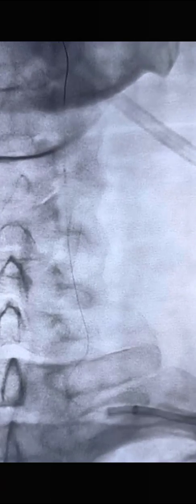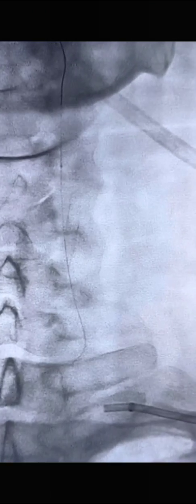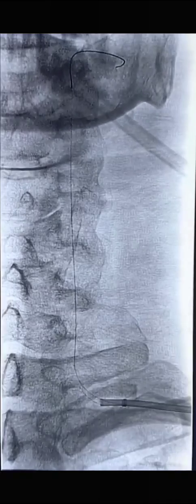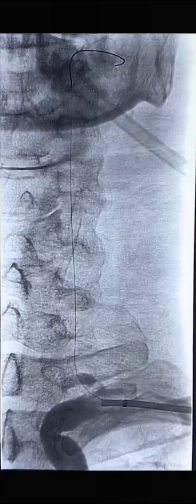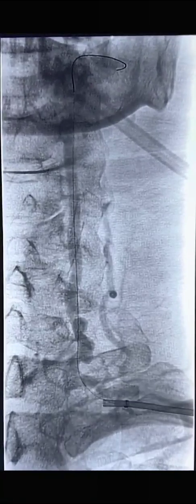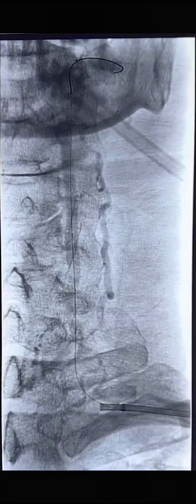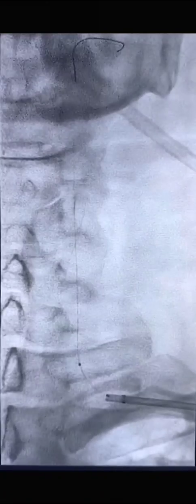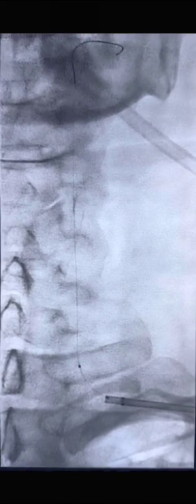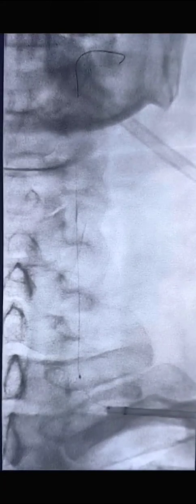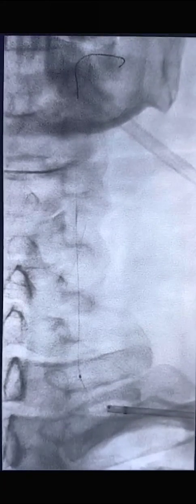The stenosis was crossed with a Traxxus 014 wire and the microcatheter was taken across. Thereafter, an exchange maneuver was performed and an all-star wire was placed across the stenosis. The stiff wire allows precise placement of the stent.